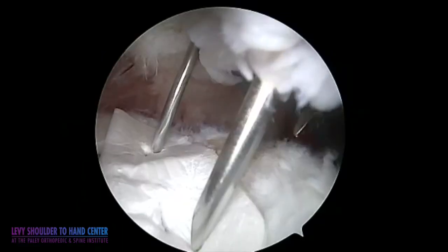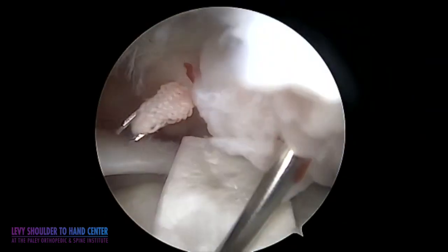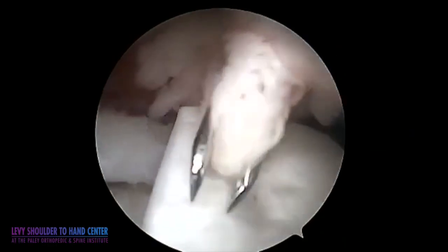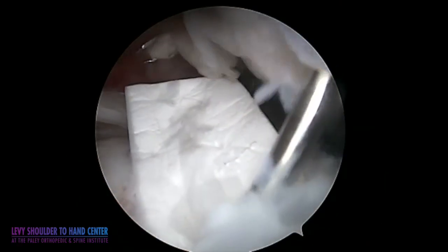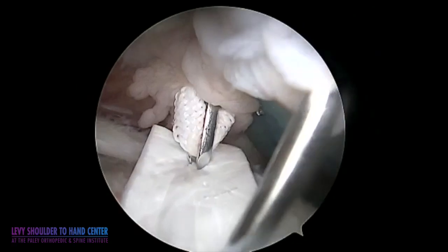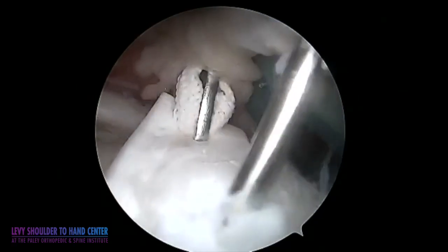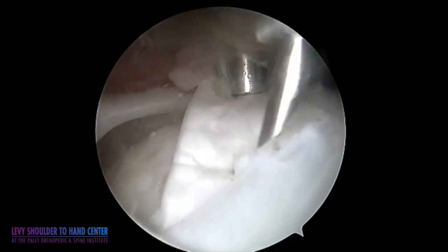I typically place my suture anchors for rotator cuff repair right at the medial edge of the footprint. In this case, an all suture-based self-punching anchor is used. By making just a spinal needle hole in the graft, it can create a leading edge to allow the self-punching suture anchor to be advanced through the graft and into the bone. So here you can see the anchor being advanced, but not dislodged from the inserter. That helps to stabilize the nanofiber scaffold, and the second spinal needle is replaced with another self-punching all suture anchor.